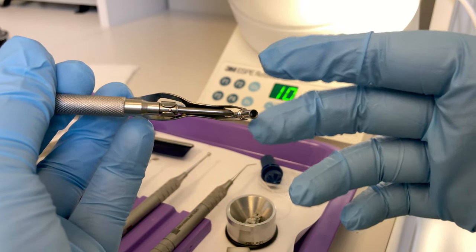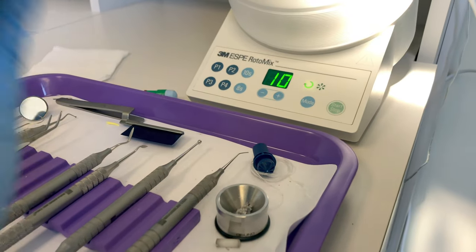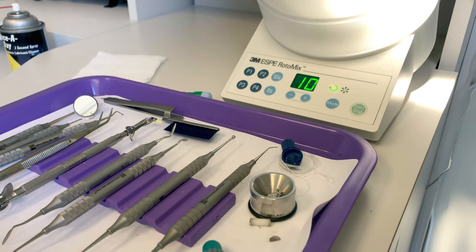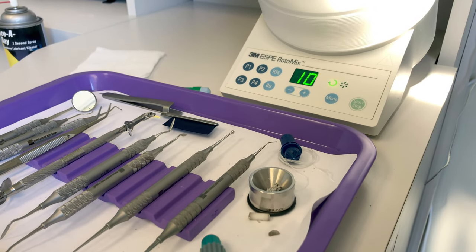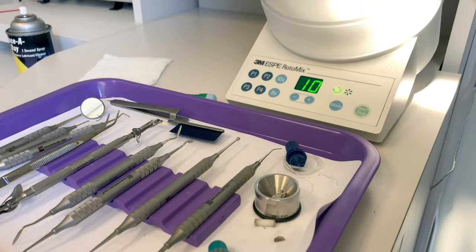The trick to get it out — you could either drill it out, or the trick is to heat it up and press. But heating up amalgam is not a great idea because of the mercury vapors that can be released, so just empty it out before you take your instruments to sterilization.